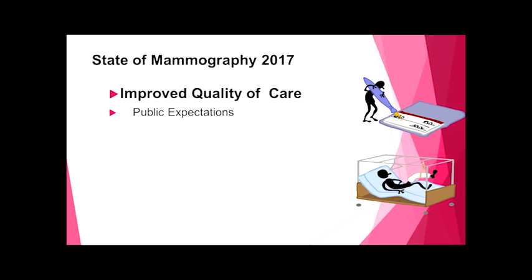So the public is well informed, and sometimes I like to say well informed, but maybe not so well informed, about what the procedure of mammography is, what it can do, what is the efficacy of the procedure. So there's a lot of public information, and it's not all correct about mammography. So we have the patient's expectations also.